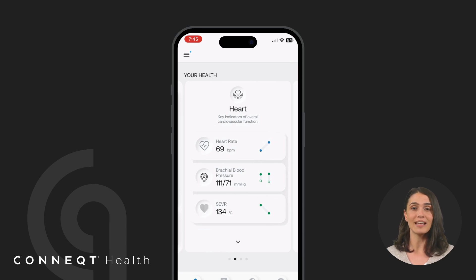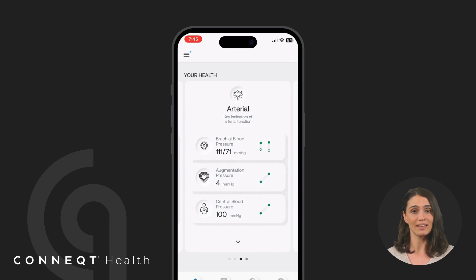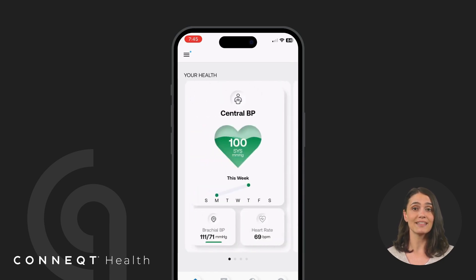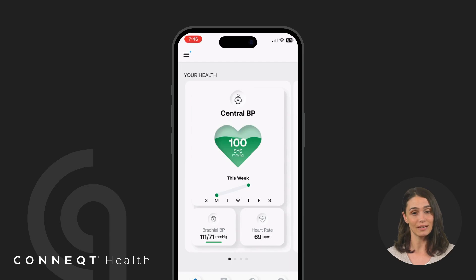For example, the heart card highlights heart rate and SEVR, while the arterial card highlights brachial and central blood pressure. These health cards make it easy to navigate and focus on what matters most to you. Simply tap on a card to dive deeper into the details of each measurement.